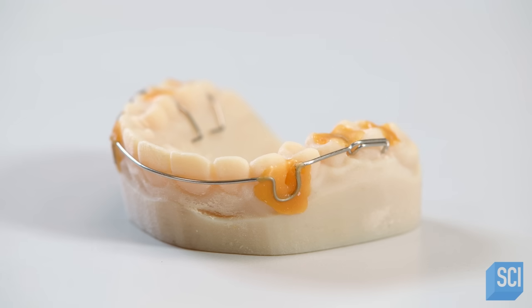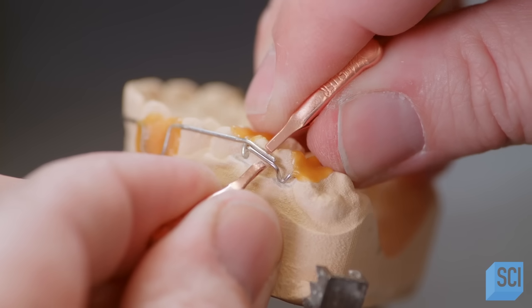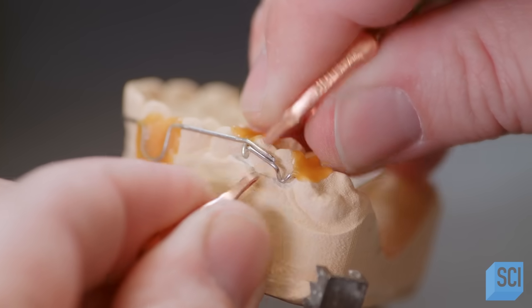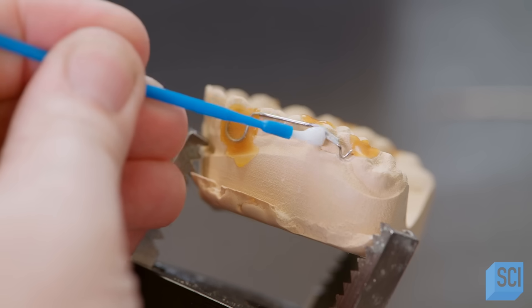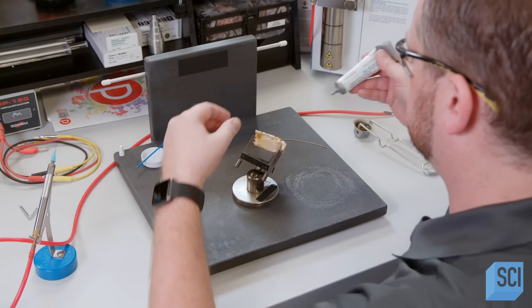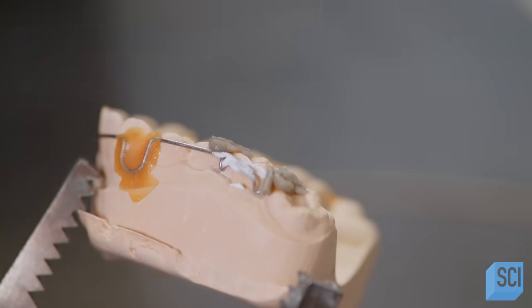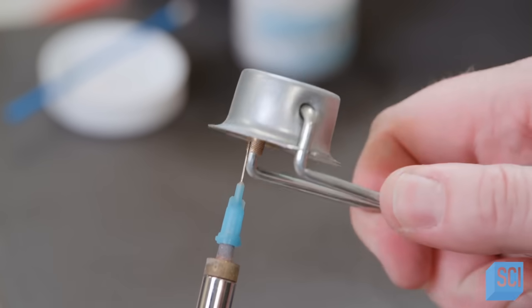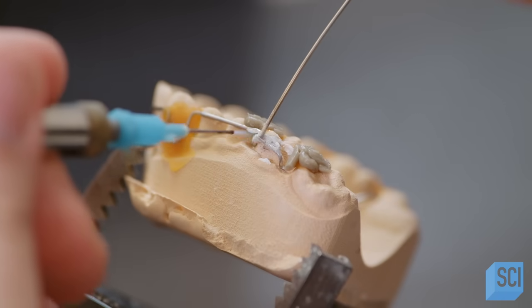Using a pulse welder, a technician tacks the labial bow and the clasps together. He applies flux, a chemical that preps an area for soldering. He also applies a heat shielding product to prevent the wires from overheating. Next, the labial bow is soldered to the clasp with a silver-based solder that's safe to wear.